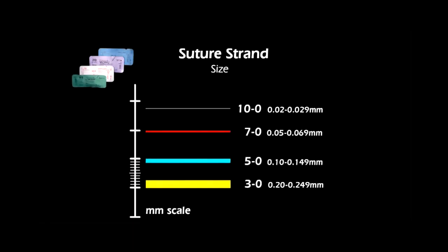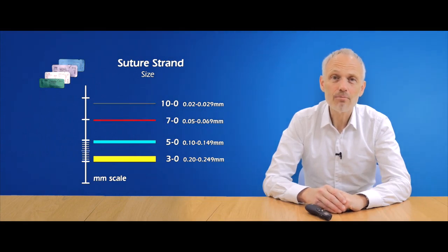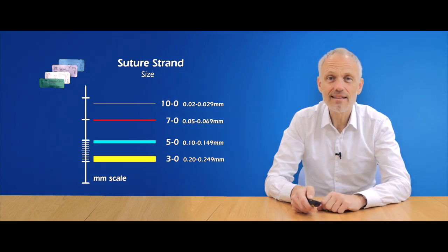We choose suture diameters in periodontal and peri-implant surgery. Very often 3/0, 4/0 or maybe 5/0 sutures are chosen. Surgeons are choosing suture material based on tradition, habits or whatever, or the price of the material, but very rarely depending on the biological properties of the sutures. Does it make sense to choose a suture with a diameter 3/0, 4/0 that can be loaded up to 10 or even more kilograms when you suture such a very little tiny papilla?